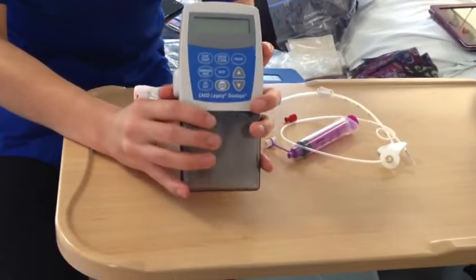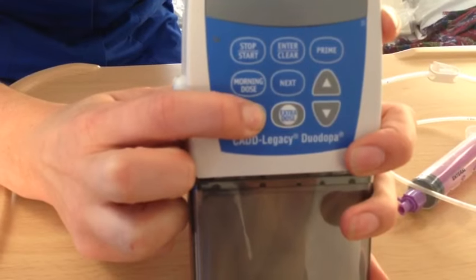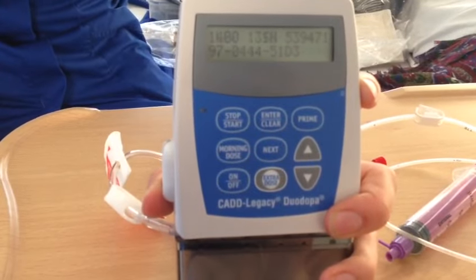Now you need to turn the pump on. Press the on/off button and hold it down until you get some writing on the screen, and then you need to wait.